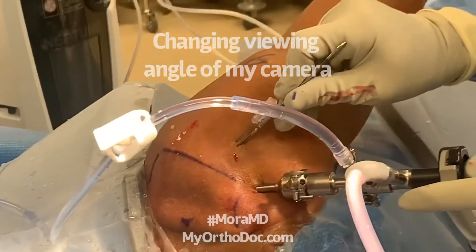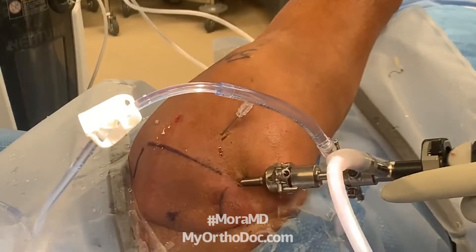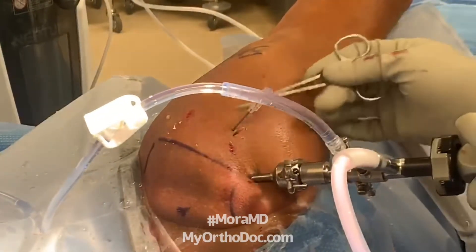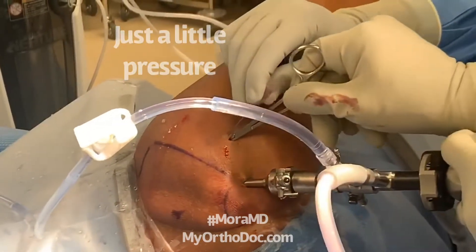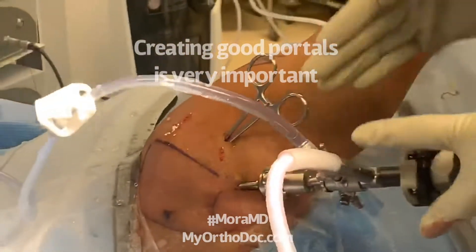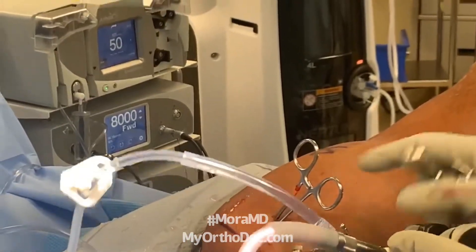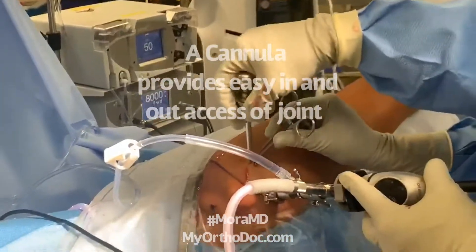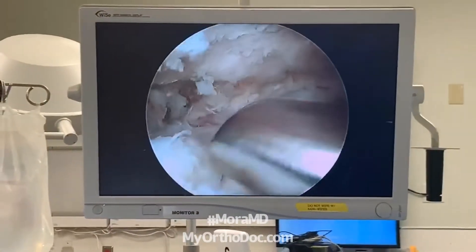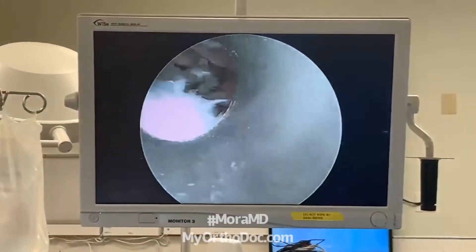If you look down here, this is how a portal is made. I already have a needle in there — the needle is my trajectory. I made a little incision on the skin and then just spread a little bit. I follow my needle trajectory, go in there, spread the tissue so any little nerves or whatever move out of the way, and then once again I follow my trajectory and go in. Now I put that metal tube in there — it's called the cannula.